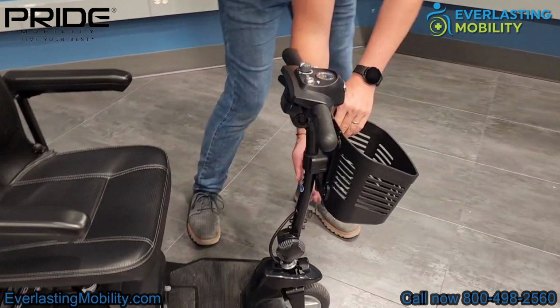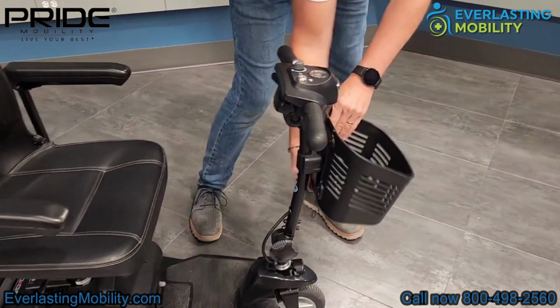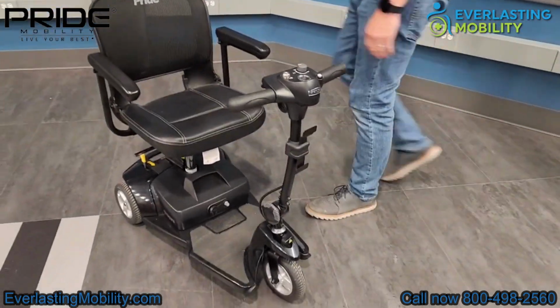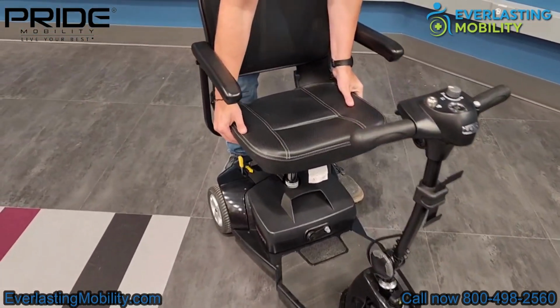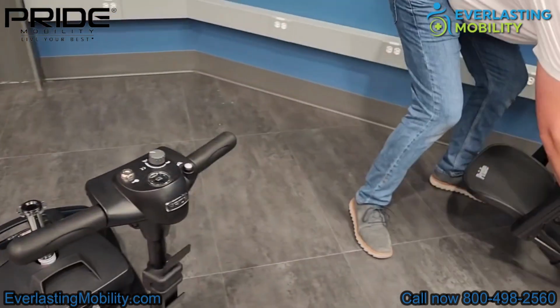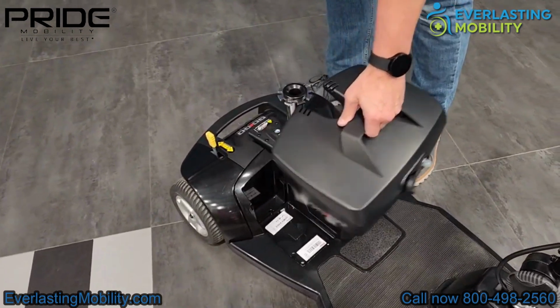First step is you would just pop off the front basket. You just tap it from the bottom and it'll come right off. The next step is you would lift the lever that you use to swivel the seat. You would just lift that up and just pull the seat straight off. Now, after that, you would just pull the battery pack off.